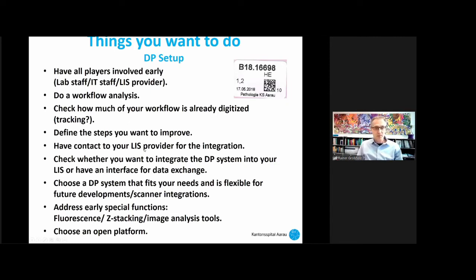Have contact with your LIS provider for the integration. That's very important because, other than in research, you need strict and 100% reliable connectivity from your slides to your patient data and your referring physician. Ask yourself, how do you want to work? Do you want to work from the DP system, or do you want to work from your LIS?